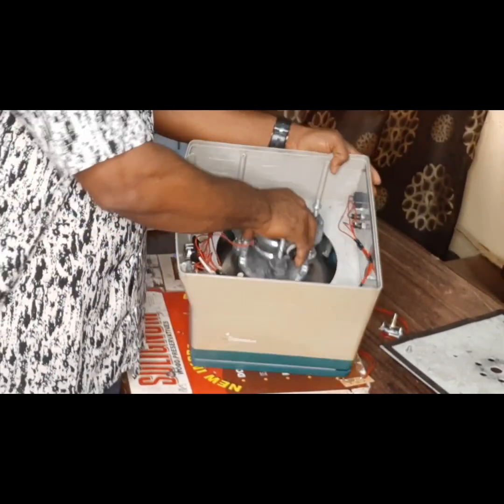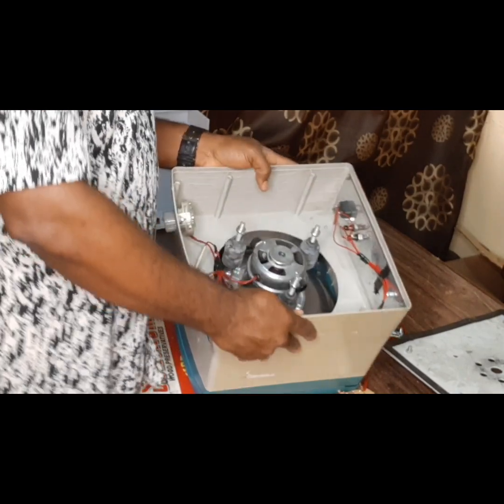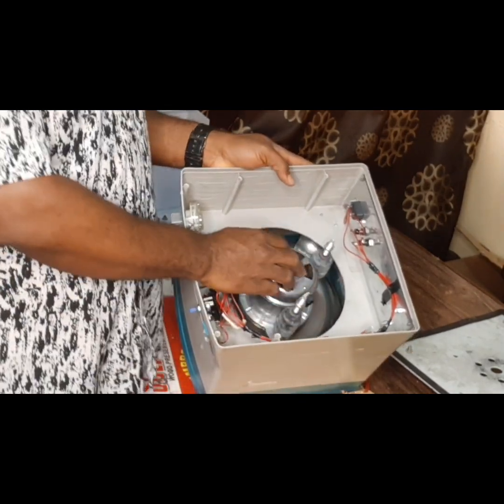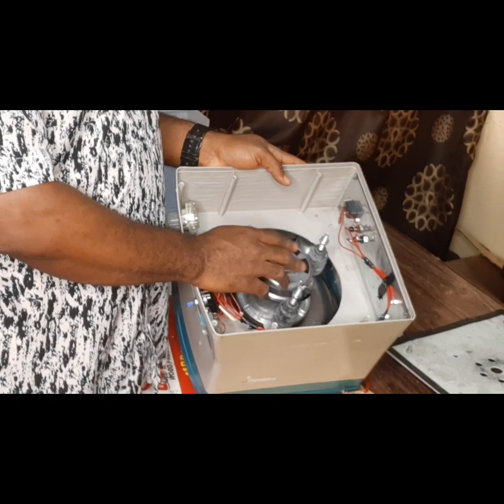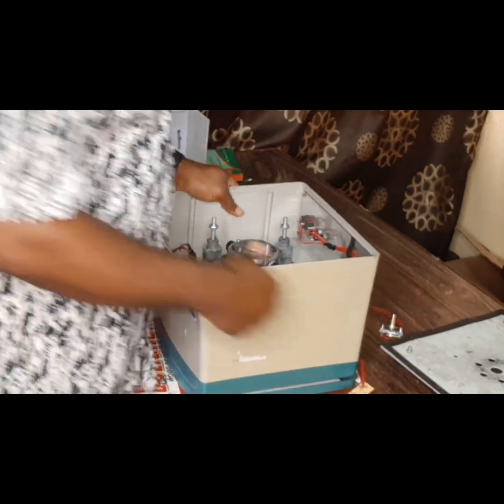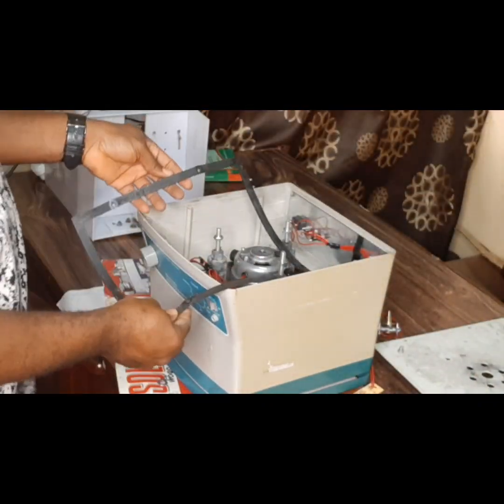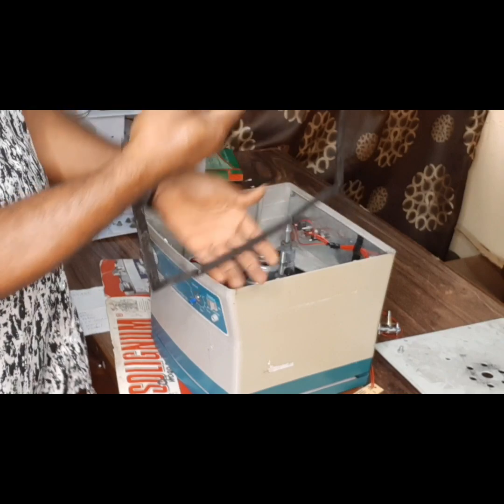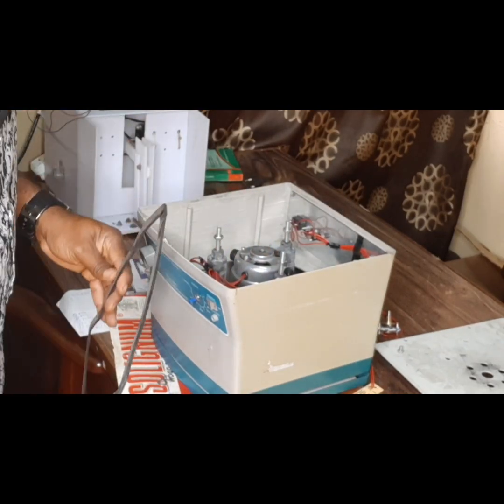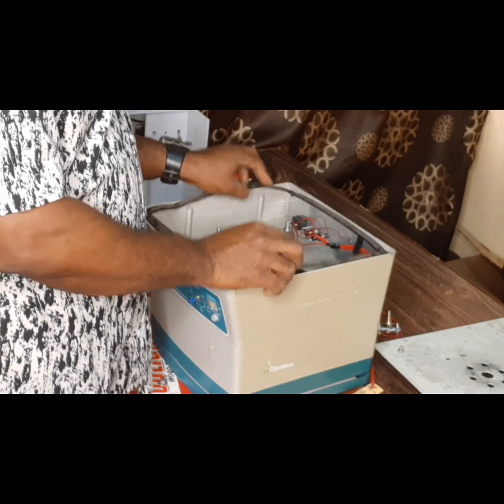You can see everything is free now. So the next thing I'm going to do is to guide the motor, because it won't be right to power this very electric motor on without guiding it. So I'm going to fix the base right now. First of all, I will need to fix the sail. I'm going to fix the sail right now to fit it.